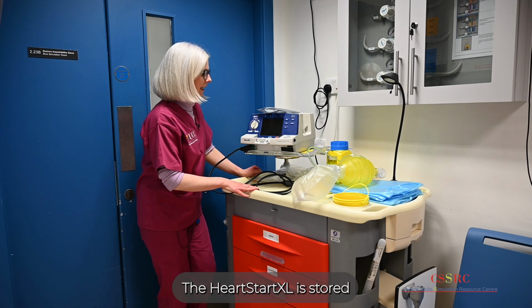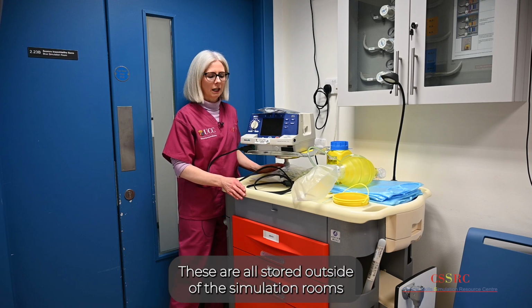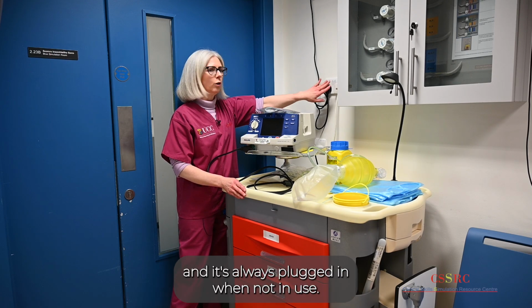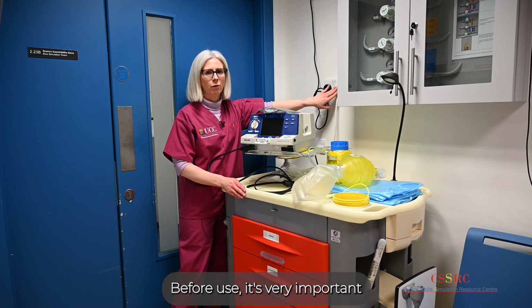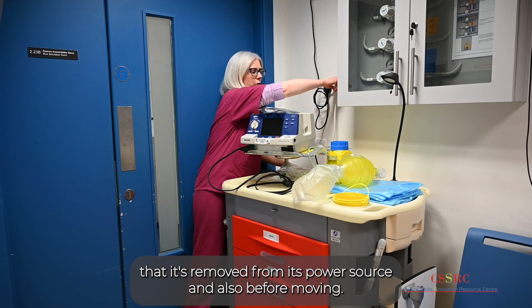The HeartStart XL is stored on top of the emergency trolleys. In the CSSRC, these are all stored outside of the simulation rooms, and it's always plugged in when not in use. Before use, it's very important that it's removed from its power source and also before movement.